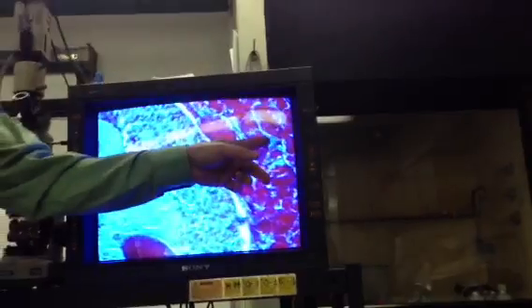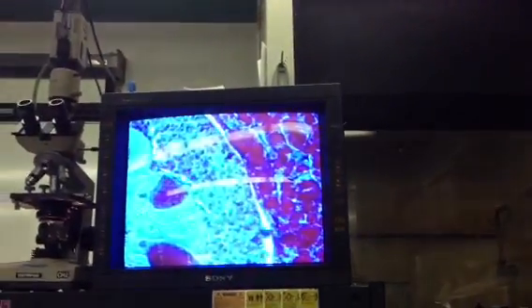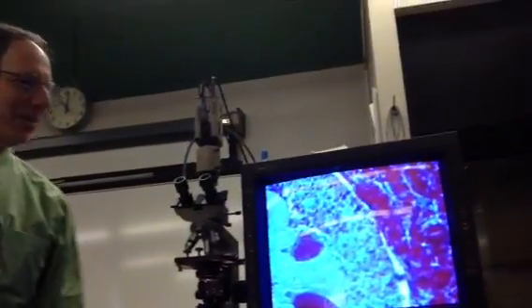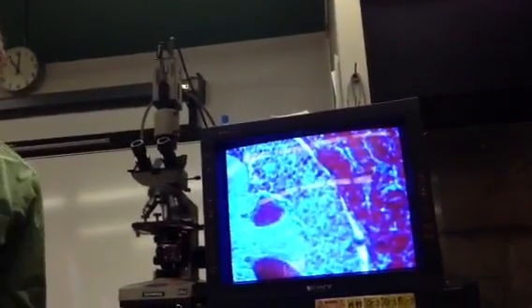If it has sort of a bluish cytoplasm stain, those are basophils, which make gonadotropins or TSH. Right? Chromophobes make ACTH or nothing. Right? Sometimes they're chromophobic just because they don't have any secretory granules, rather than POMC.